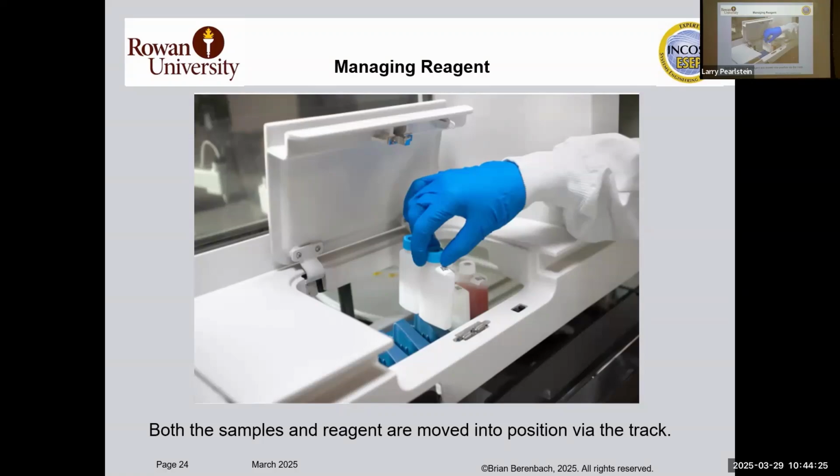Now, why is this important? This is important because this is how the company makes its money. The company doesn't make its money on the analyzer, which initially is very expensive, but that's not going to cover all the costs and the engineering. So you pay for the reagent, just like you pay for the ink in a printer, right? It's the same idea. The reagent comes ready to put in. You just take the cover off, and in she goes.